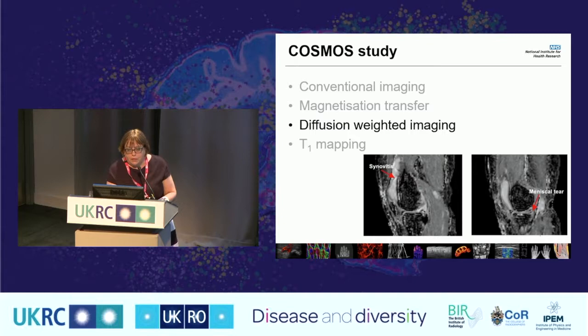Diffusion-weighted imaging was the next door that I knocked on. And again, we use it in the neuro world. We have a lovely 3 Tesla scanner up at Chapel Allerton in Leeds, but it's 10 years old now, and unfortunately, it was an MSK-bought magnet, so we didn't have all the fancy neuro stuff. So my diffusion-weighted imaging was a bit of a shocker, but trying to do it on a neuro scanner, which I might do soon, may give different answers.